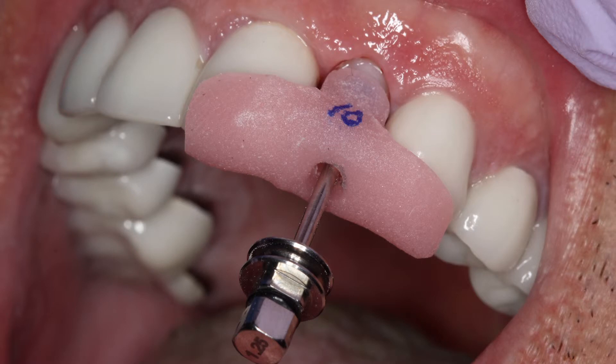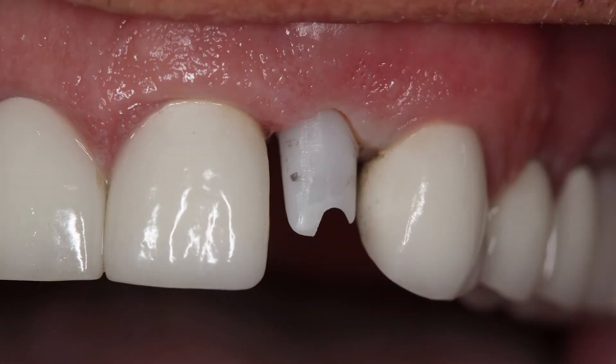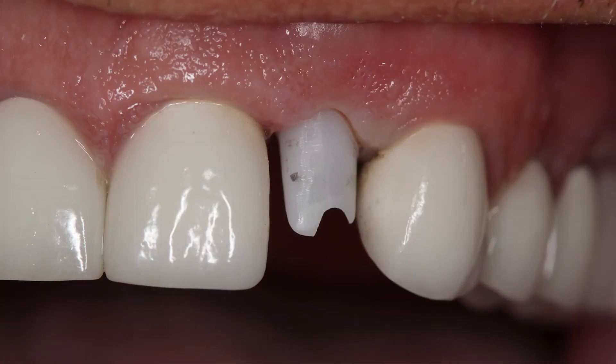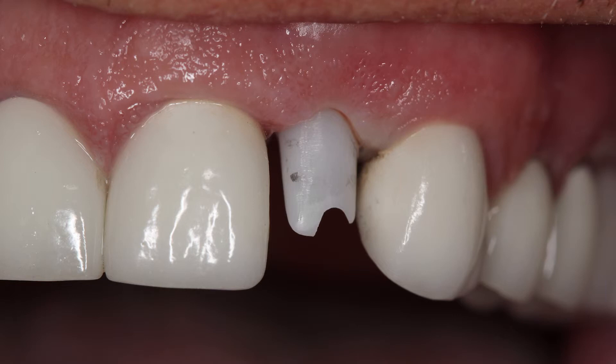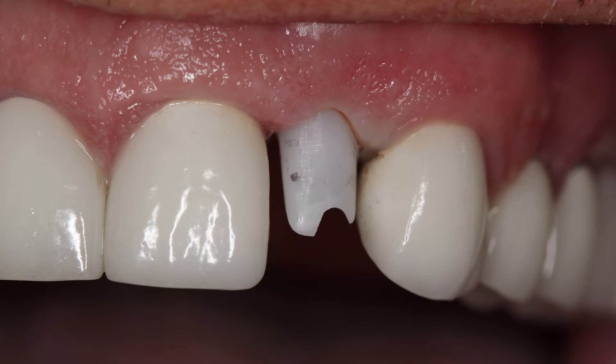In figure 5, we see that this custom abutment was properly seated using a positioning jig provided by Glidewell Lab and torqued to 25 newton-centimeters. The custom abutment was designed in position to facilitate a natural emergence profile for the final IPS e-max crown. The margins are slightly subgingival here — they don't need to be extremely subgingival.